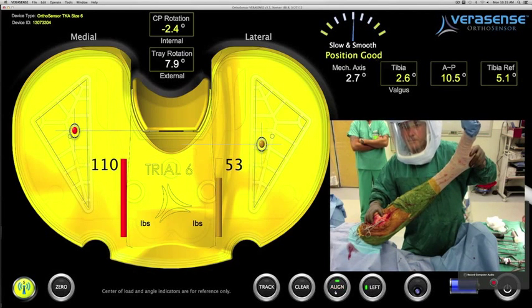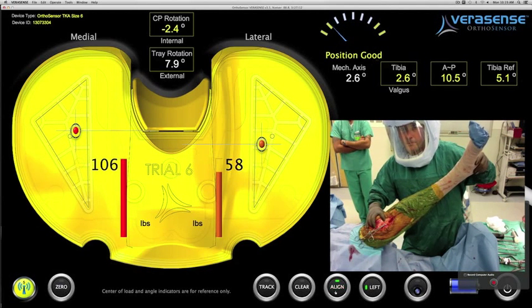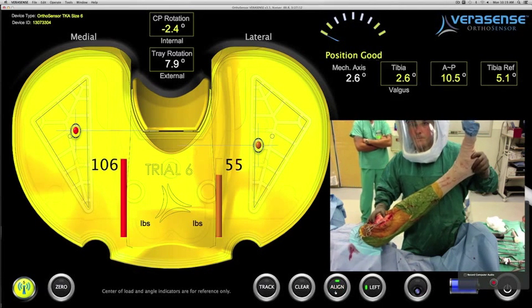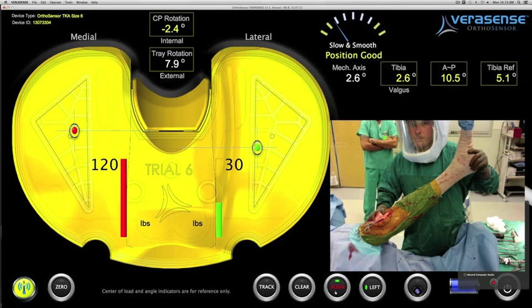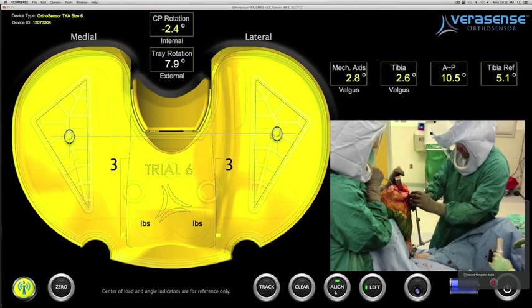The surgeon now takes the knee into extension and rotates the hip joint to incorporate the distal femoral angle, and the computer will show him the overall mechanical axis. In this case, the overall limb alignment was seen to be still in valgus at 2.8 degrees.